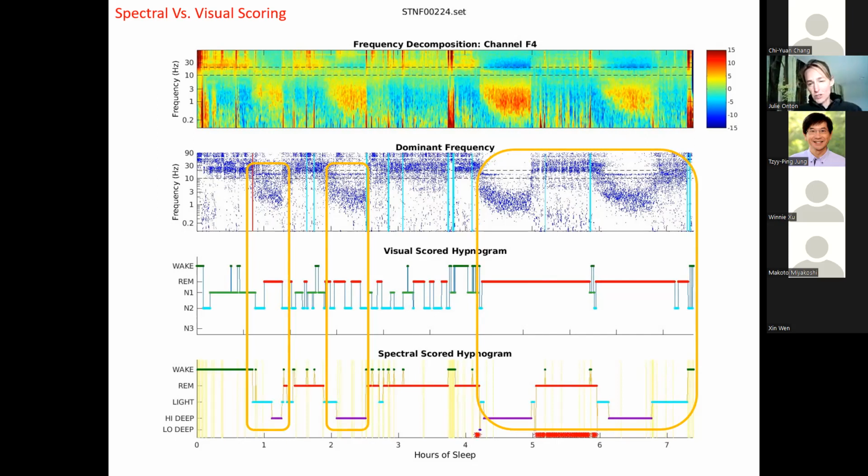This one is not visually very strong, but it caused the original scoring from the hidden Markov model to say low deep sleep. But I have a post correction: when it scored low deep sleep, if there was an absence of spindles, then it gets rescored to be REM. So I see, that catches that problem of low frequency activity not always being low deep sleep. Okay, I see.